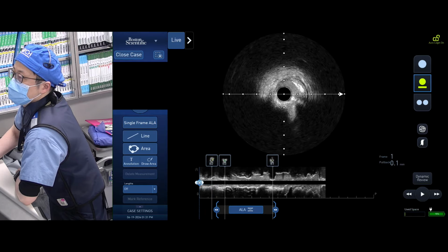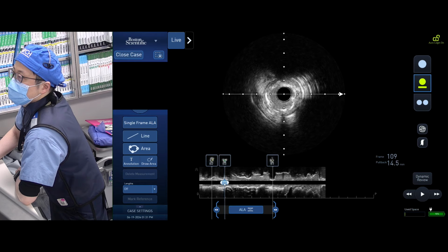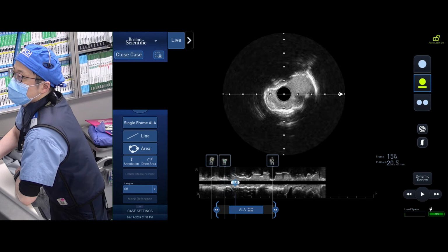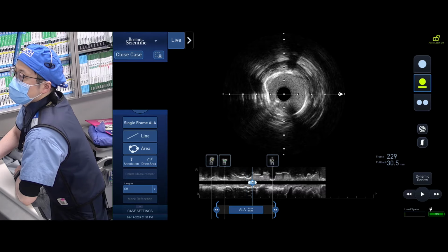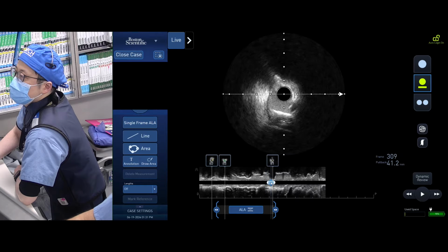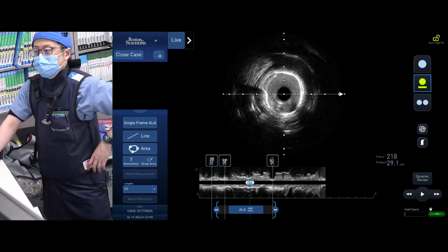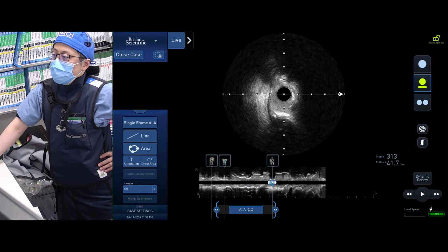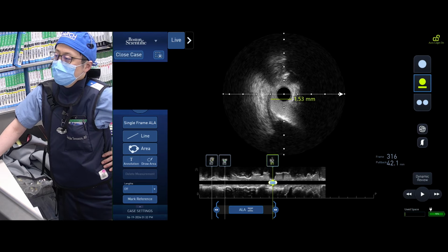In this kind of lesion you can do a cutting balloon also, but I think IVL probably will get a better expansion. Your IVUS actually was very fast and it jumped around that angle. You actually have more calcium, 270 degrees of calcium, in the proximal ostium of the diagonal. And then you look at your nodule. Part of the nodule is completely gone. It's black. That's why I think the shaving was essential at that level.